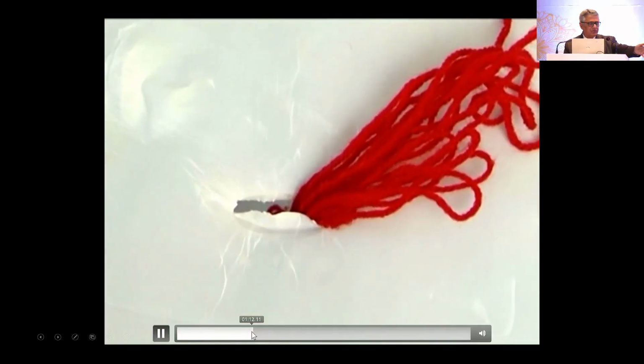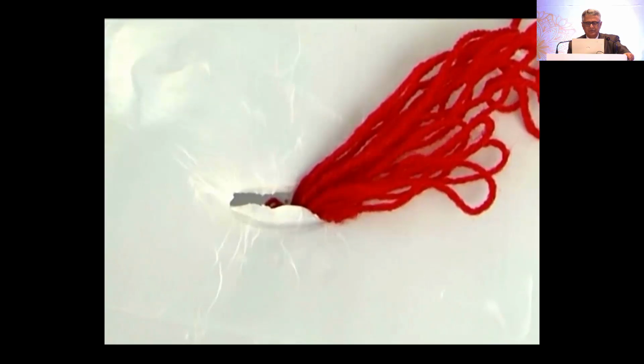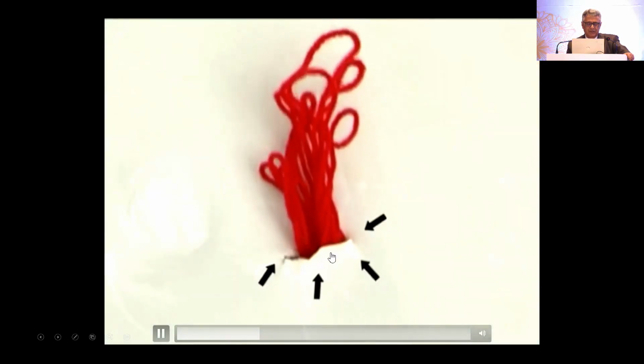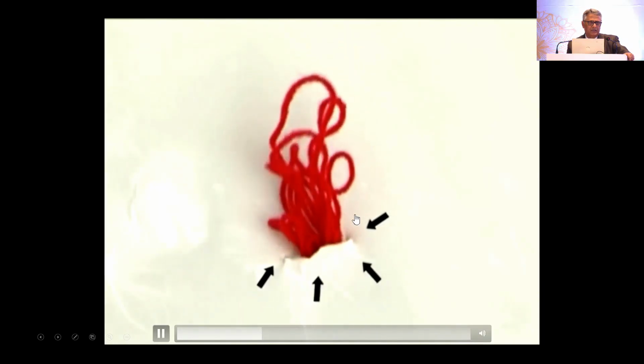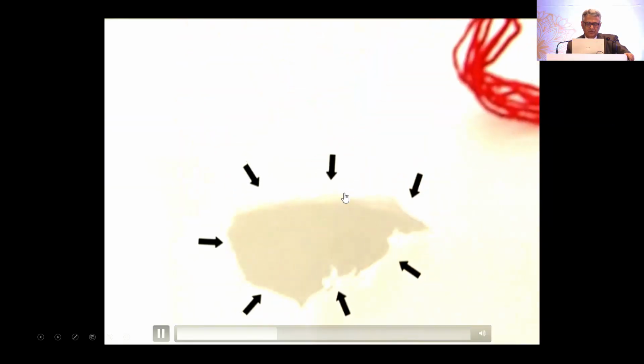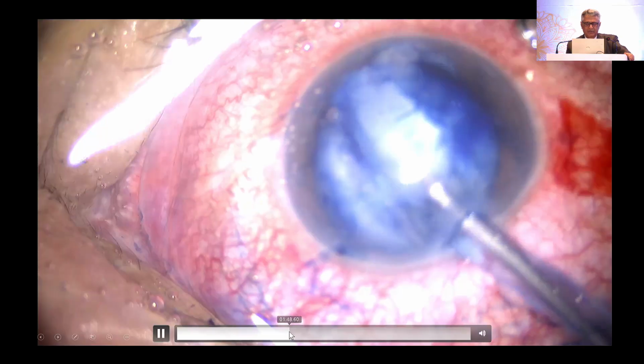This is what Shal also showed, and I copied this from YouTube of Vasavada, where if you do it from the posterior segment, you are pulling it inside. But if you do it from the anterior segment, you are making it larger. There is a possibility that it will increase. So you see how ragged, I think I will not repeat this.